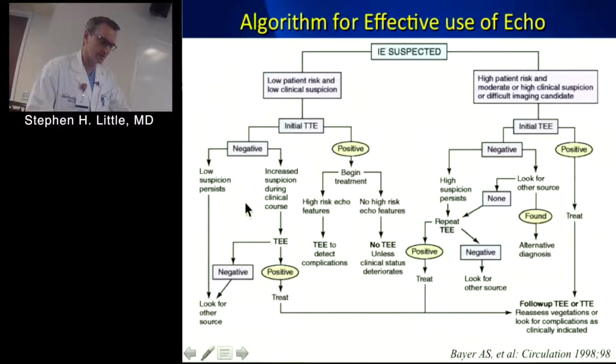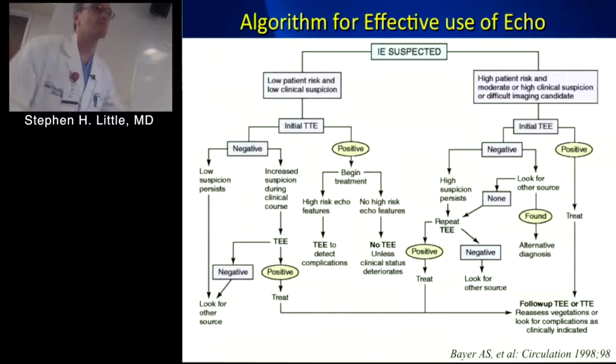Dr. Q, any comments on this algorithm? I actually reviewed a paper a few months ago, and they did something cool. What they were trying to do is modify a little bit what counts as a negative transthoracic. Pristine quality, clean, negative, no. Positive, definite, great. The question is that there's always a lot of in-betweens.